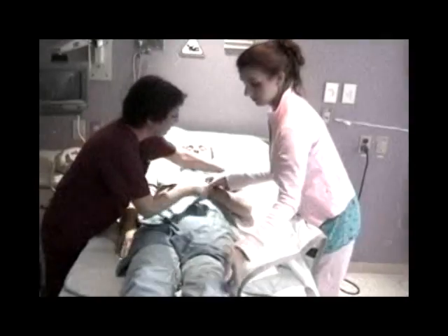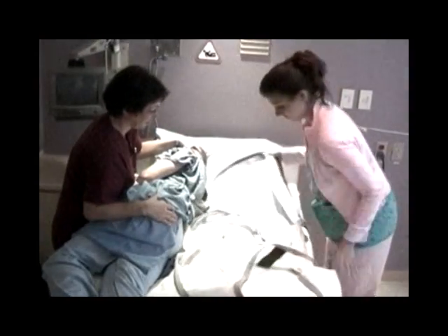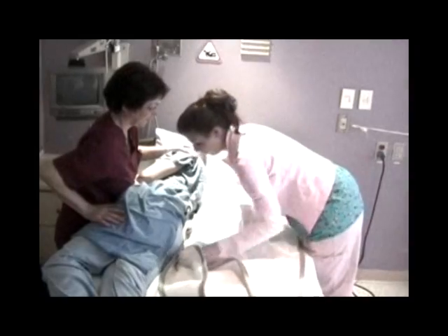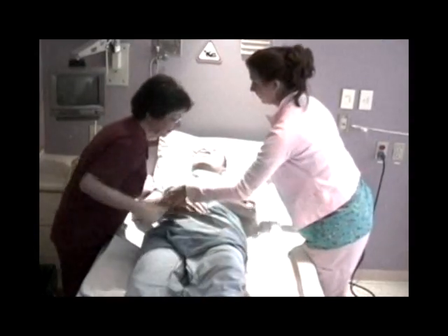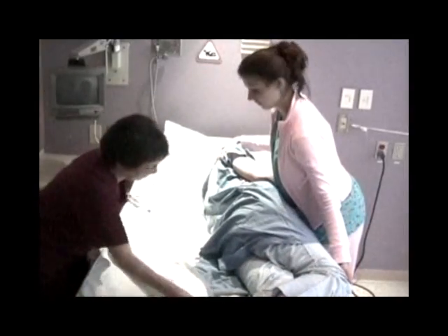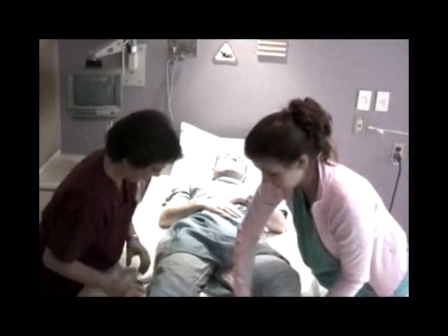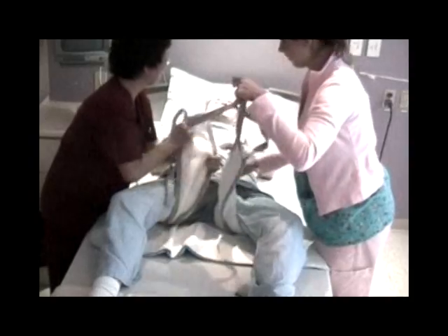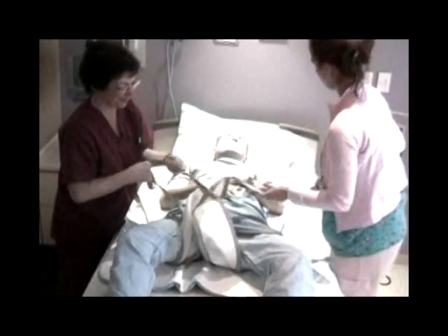Procedure for transfer from bed to chair using the total mechanical lift. One caregiver should assist the patient to roll towards them, utilizing the log roll. The second caregiver will slide the sling under the patient. Log roll the patient in the opposite direction and pull the sling through to straighten. Roll the patient onto back. Place the leg strap around the patient's legs. Instruct the patient to fold their arms across the chest.